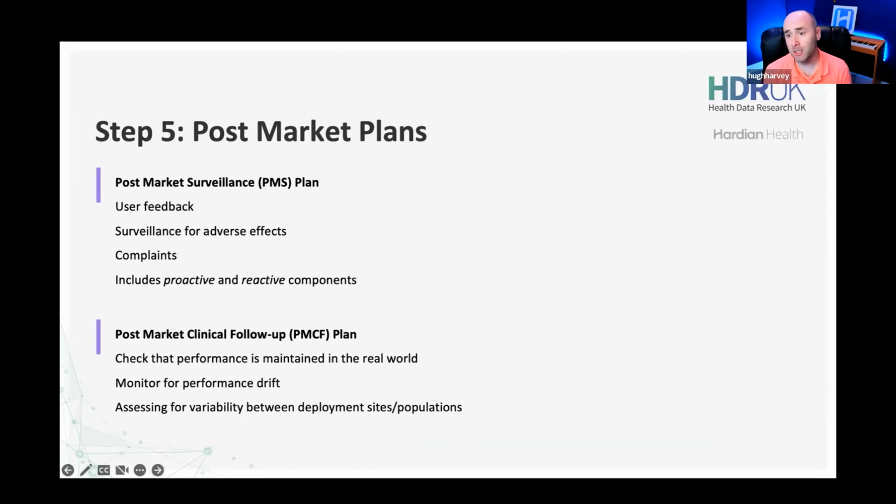It's also well known, especially for AI-driven devices, that devices do not work off the shelf as well at different sites. Sometimes you have to go to a site and retune or retrain. So that's allowable under the medical device regulations. It's a myth that you can't. You absolutely can. It comes into your post-market clinical follow-up, whereby you can monitor and deploy in a hospital setting, for instance, measure the performance, and then come back and, within standard operating procedures, have a predetermined methodology for fine-tuning your algorithm to work in that hospital.